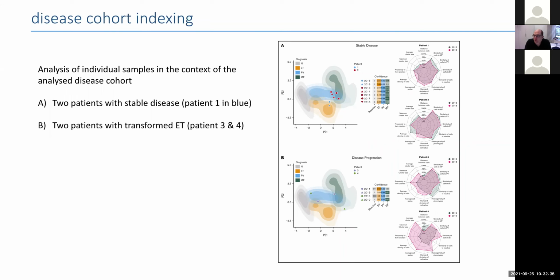If you, however, look at the distance between two histograms, or the evolution of two histograms over time, there's some very valuable information here. What you see on the right are first and second order principal components, where we project changes in that phenotype signature.